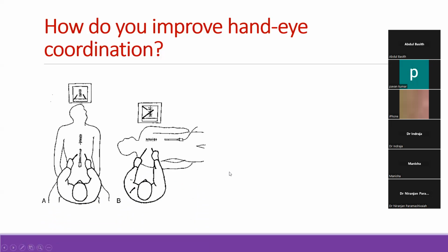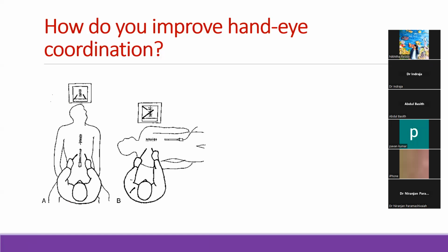The monitor should be in one axis. Yes, one axis. Your hands, your eye, the organ in question. This is your eye here. Okay, this is a fundoplication, for example. And the monitor must be in one line.